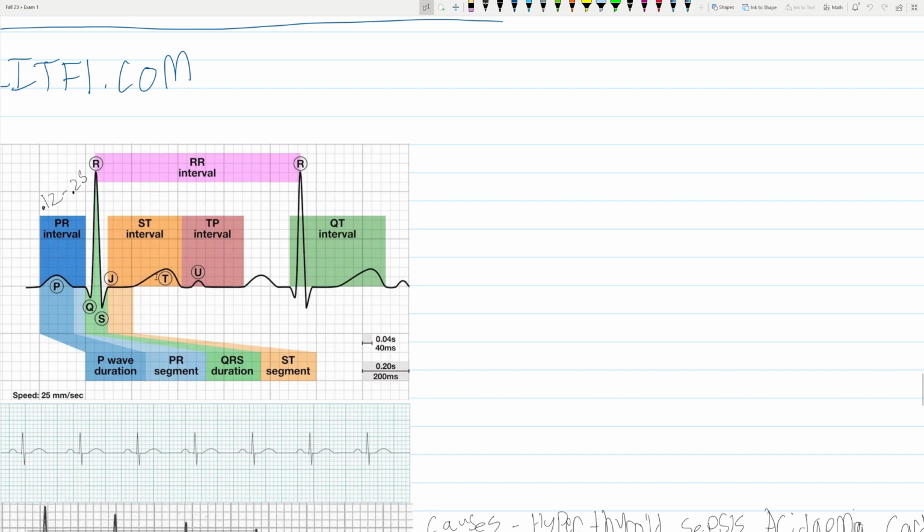Okay. Now you're going to ask yourself, well, I said we have a depolarization, depolarization, repolarization. Where's the atrial repolarization? Atrial repolarization is typically going to be masked by the QRS complex. The reason is that when we're measuring this electrical activity, the highest millivoltage that we read off of this EKG is the one that is recorded.